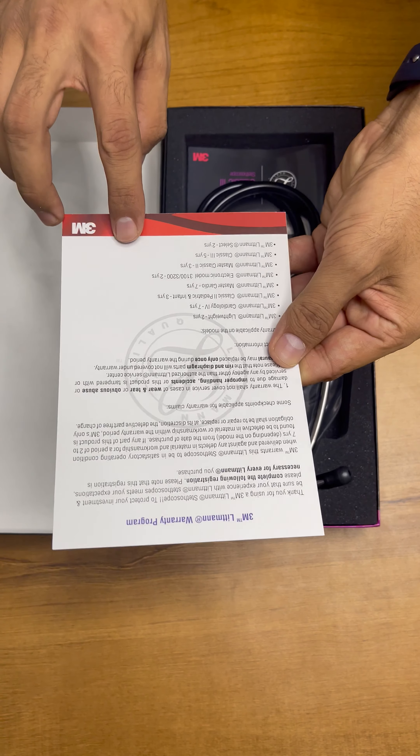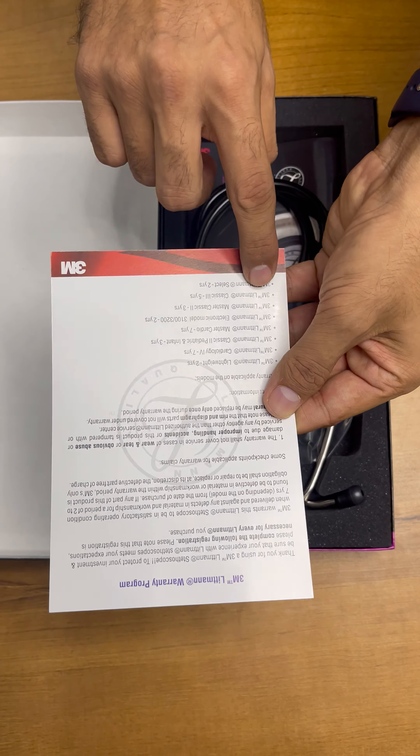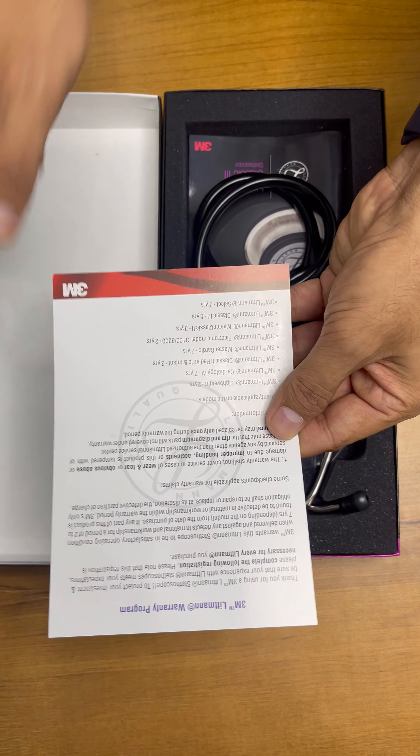The company has given a warranty card. This device has around a 5-year warranty — 3M Littmann Classic 3, 5 years warranty.